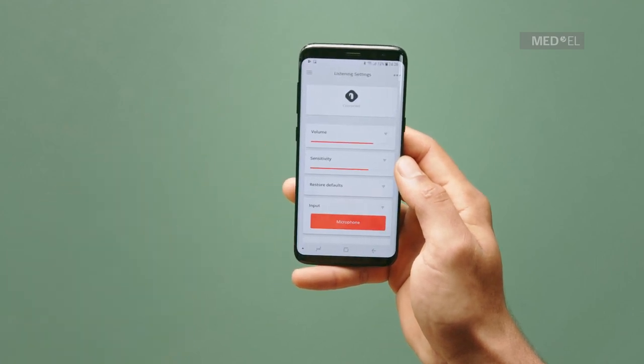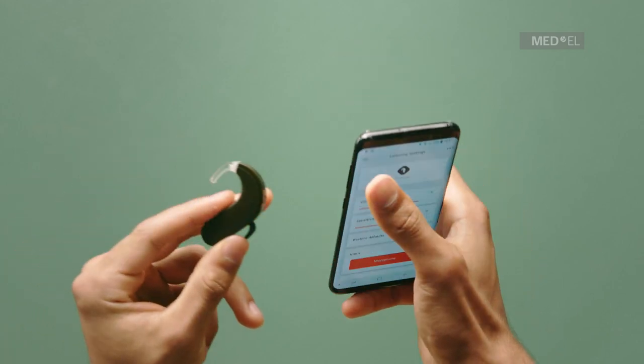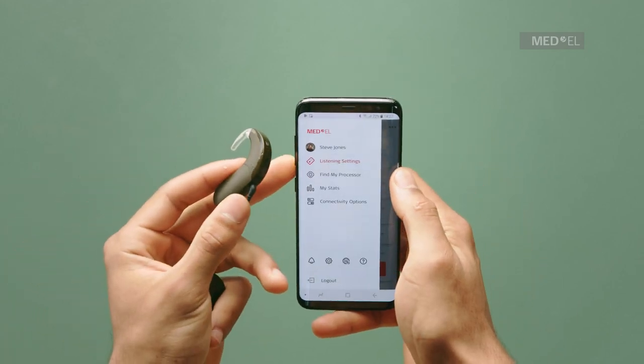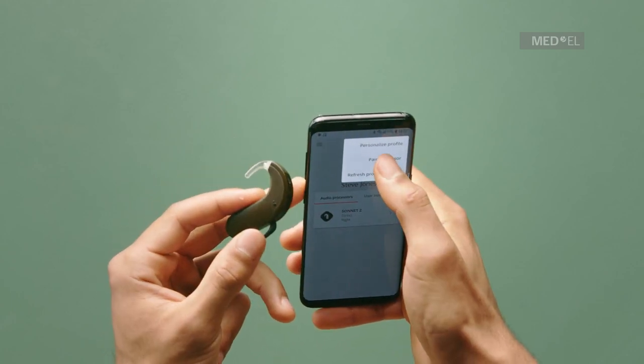If the audio processor belongs to your child or someone you look after, then tap Create User. Enter their name and tap Create. Your audio processor should now be paired with AudioKey.